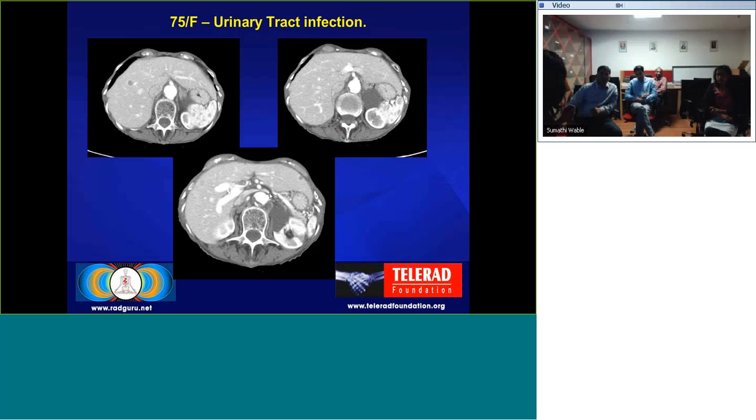In MR, you can be more certain because you have the help of many other sequences. In CT, many times all you get is one phase. So I've seen these being called hemangiomas there, when I was at Einstein. And we don't need to call it indeterminate either. You can say, given the history of whatever, at least prioritize. I think this is what it is, so at least they know your level of suspicion, instead of just saying it is indeterminate.